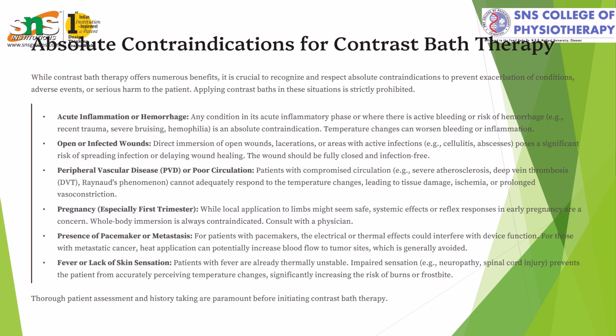In absolute contraindications, we see acute inflammation or hemorrhage in that particular area, like recent trauma, any hemorrhages, severe bruising, and any hemophilia; we can't give the contrast bath. Open or infected wounds, we can't give. We already said open wounded areas, we can't give it. Lacerations also, we can't give. If there is any active infection like cellulitis or abscess, we can't give the contrast bath therapy to the patients.